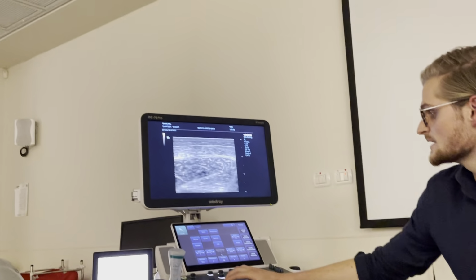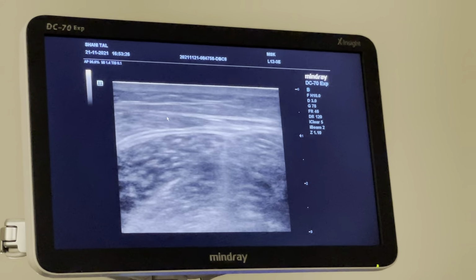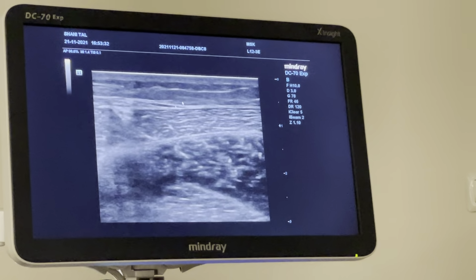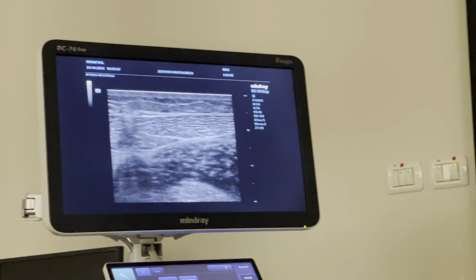So this is then the medial gastrocnemius, and if I go to lateral, here you have the separation. Lateral isn't appeared yet, so we have to go a little bit up, and this is lateral gastrocnemius muscle. So that would be the Achilles tendon and calf muscles.